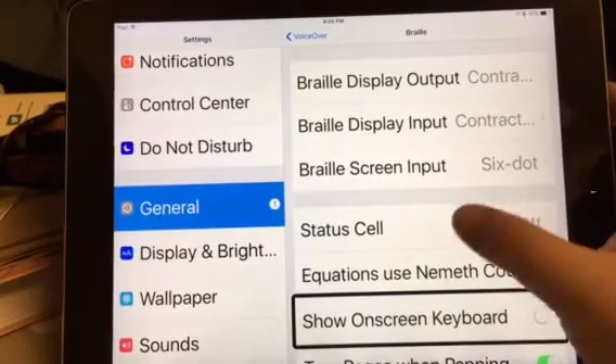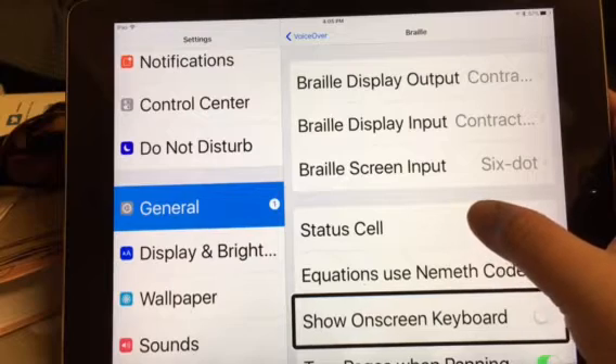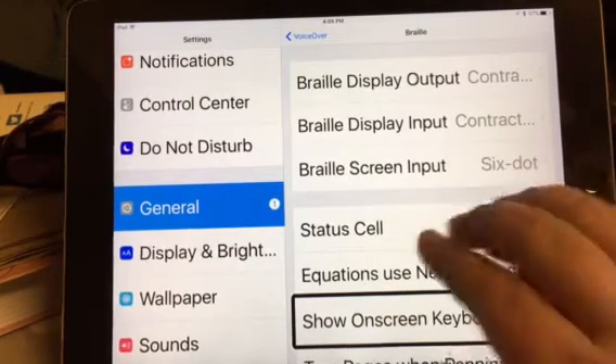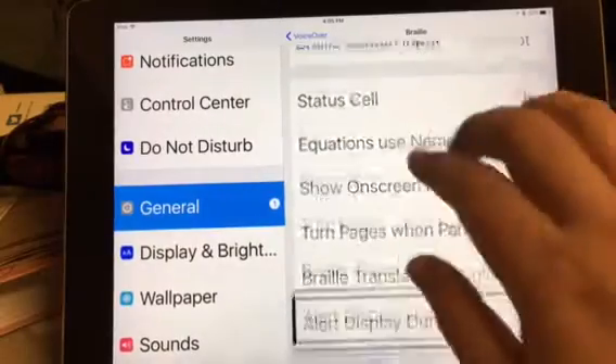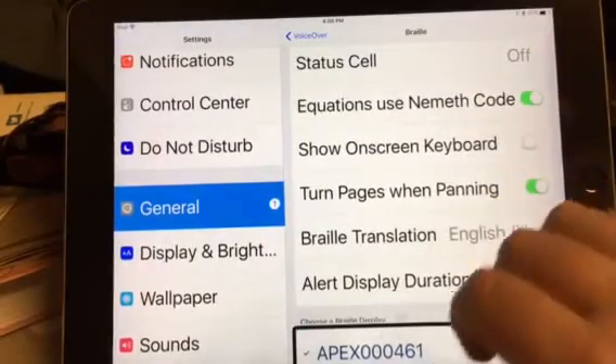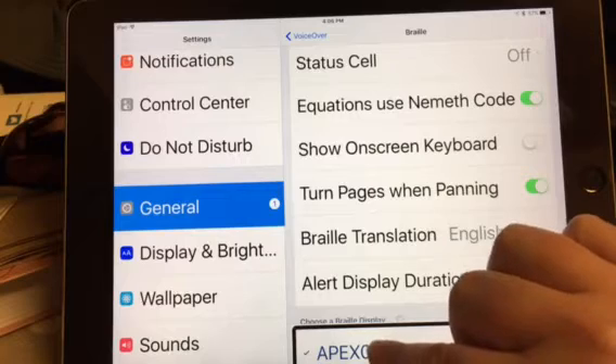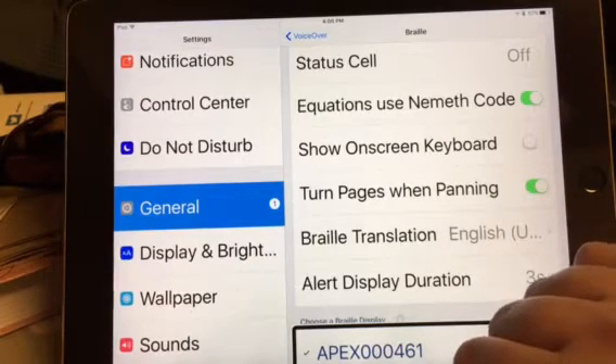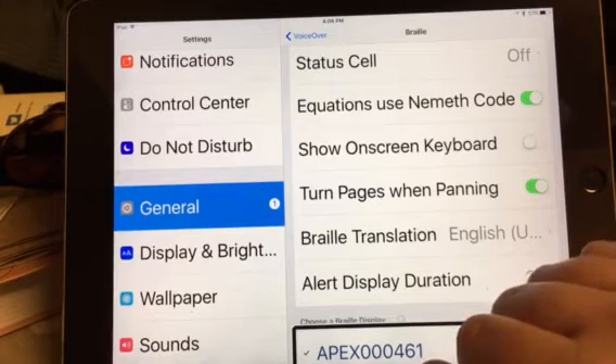So I put in the code 0, 0, 0, 0, 0 for my Apex to connect. We'll scroll back down, and I'll click on the Apex at the bottom of the screen. Selected. Apex connected. So now it's connected.